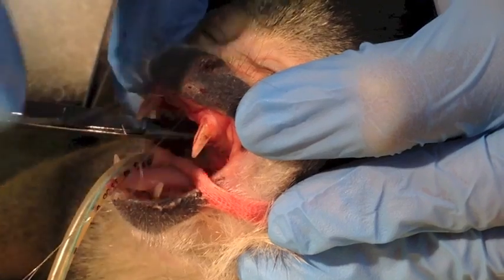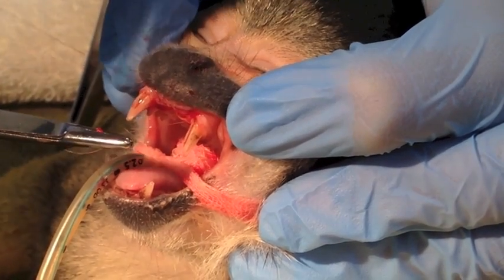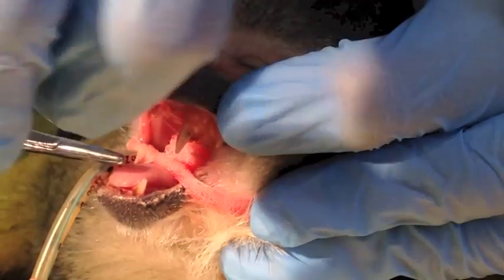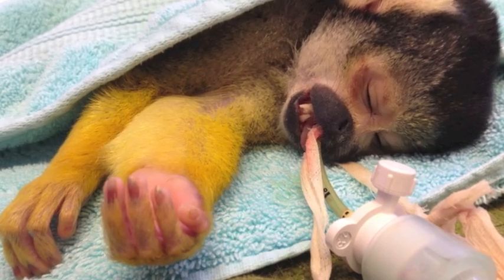If you're worried about dental drills and tooth extractions, then I don't blame you, but fear not. Jake is not only under general anaesthetic, he's also received local nerve blocks, which just means he's going to be recovering in comfort once he comes round from his general anaesthetic. Now all we need to do, the problem teeth removed, is sew down that flap we raised initially. And this is the fiddliest part of the whole operation, and Jake should have a really great recovery and no more nasal discharge.